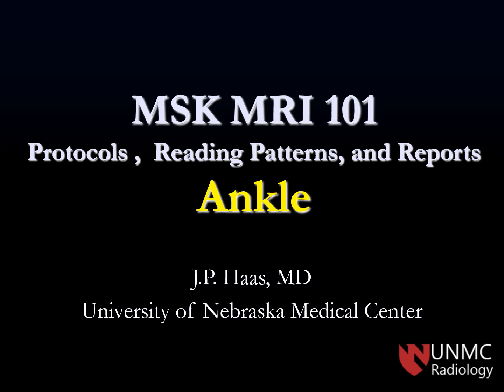Hello, this is JP Haas, MSK, and I am going to do MSK MRI 101 for the ankle. This is a starting point module or basic foundational thing to try to get comfortable reading ankle MRI when you first get to the bone reading room. It has protocols, reading patterns, and reporting with multiple normal images.